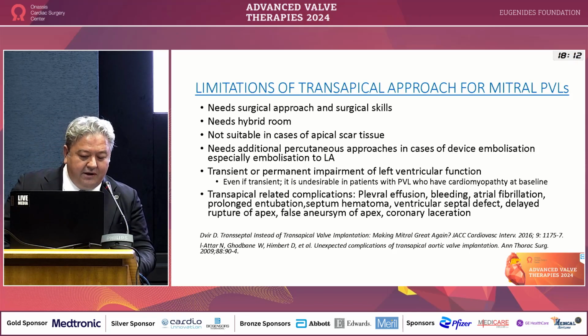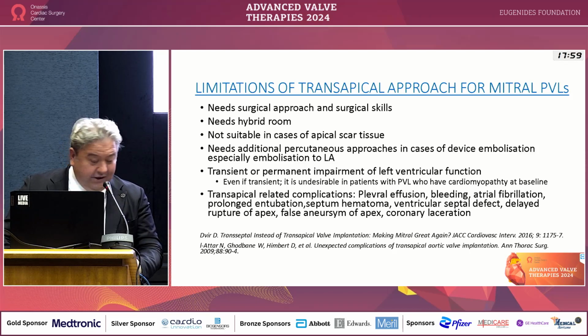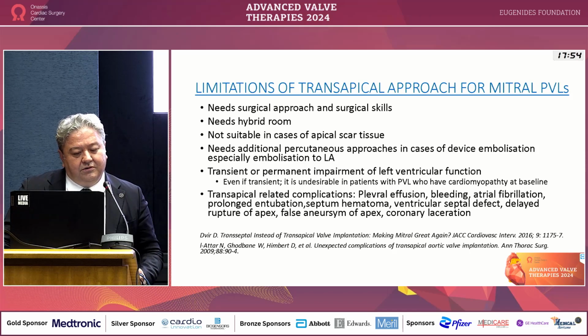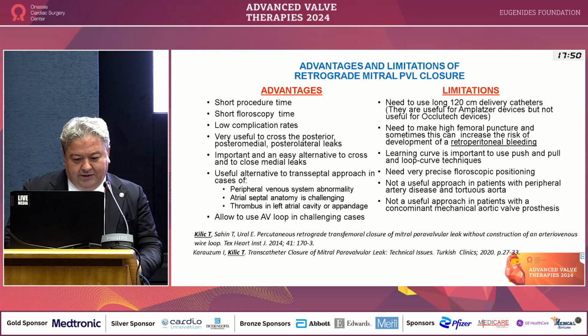And the transapical related complications like pleural effusion, bleeding, atrial fibrillation, prolonged intubation, septum hematoma, ventricular septal defect, delayed rupture of apex, false aneurysm of apex, and coronary laceration risk. So it is very, very important for an interventional cardiologist to learn the retrograde approach, I think.